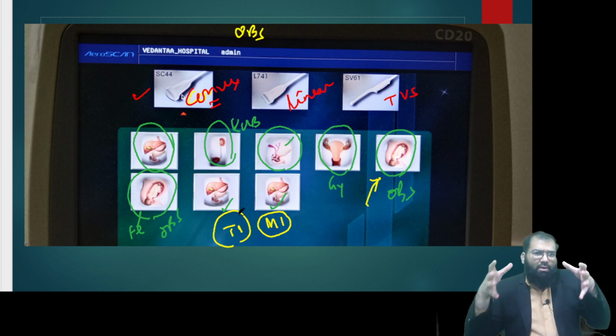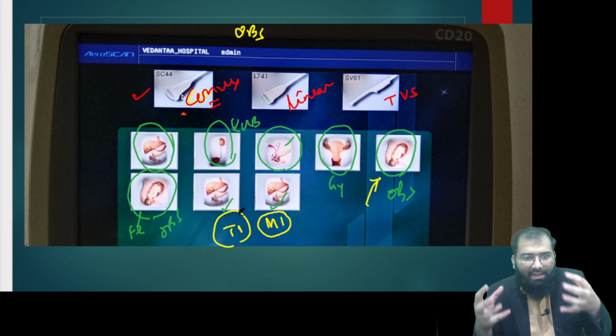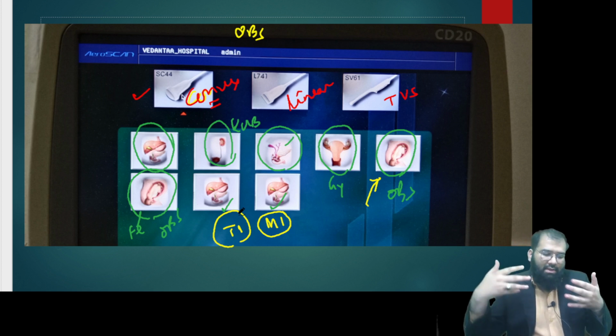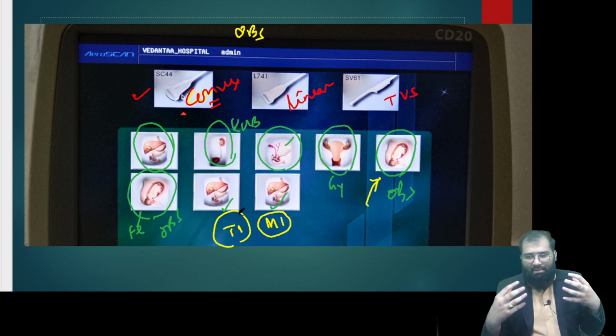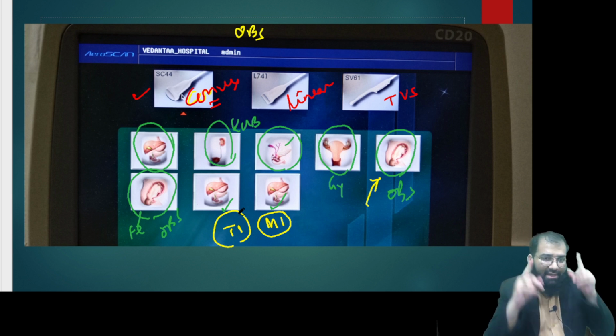When there is ultrasound, ultrasound is an energy, so it has a mechanical effect. Similarly, it's a sound energy, so it has some thermal effects. When it is transmitted in the tissues, it has thermal and mechanical effects. So we want the thermal and mechanical effects to be minimum, especially when the female is pregnant, especially in the fetus.